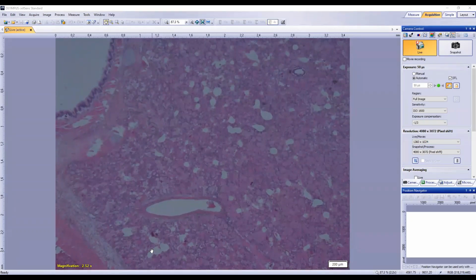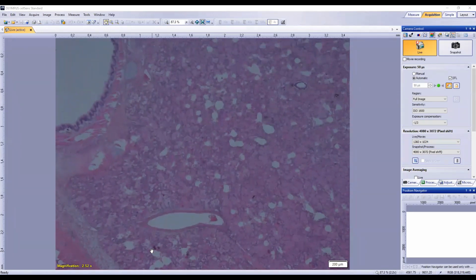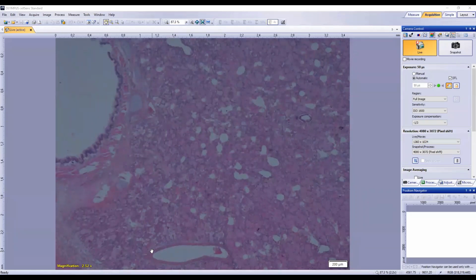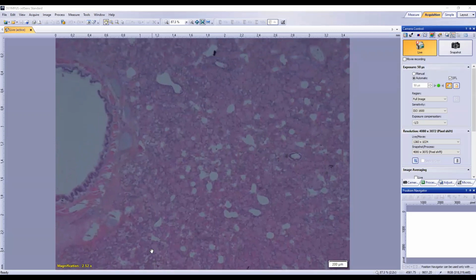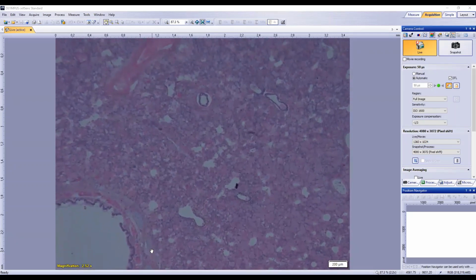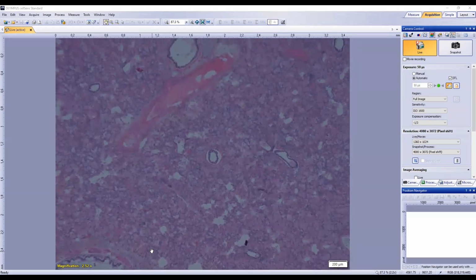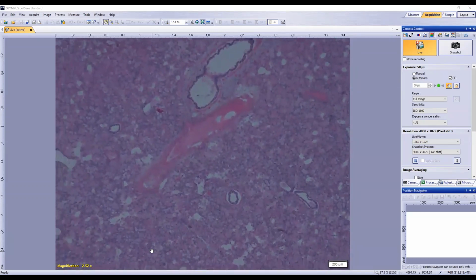And I guess what I'm getting at with the question about the interstitium is we're still thinking this is more likely an acute process, yes? Or acute to subacute. And what I'm getting at is how far along do we think it is, and what features within the interstitium would help us to distinguish that. Pneumocyte. Perfect. That's an excellent question.